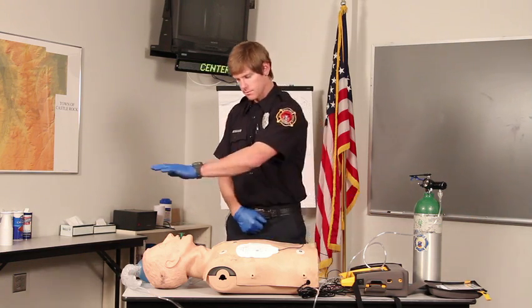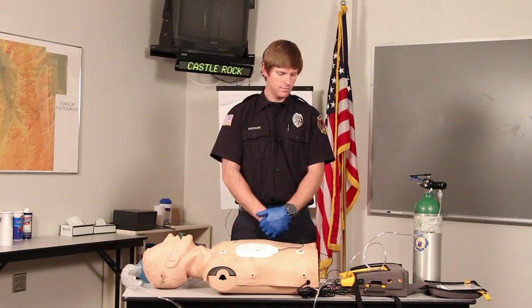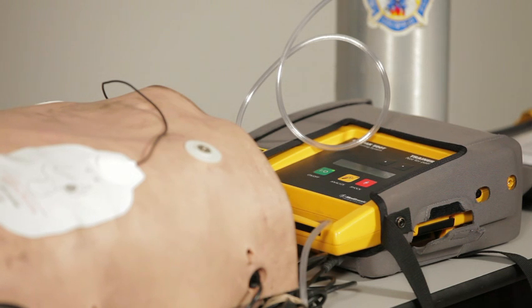Stand clear. Analyzing now. Stand clear. Shock advised. Stand clear. Push to shock.